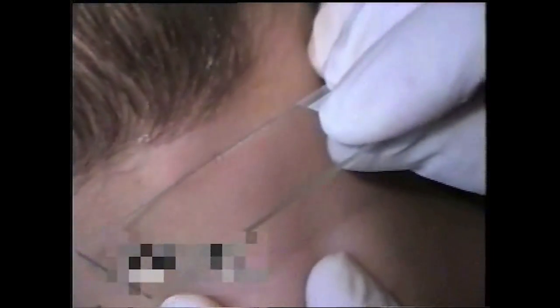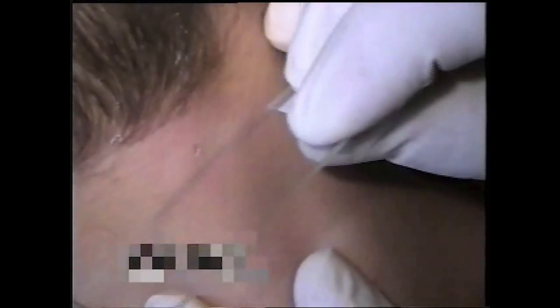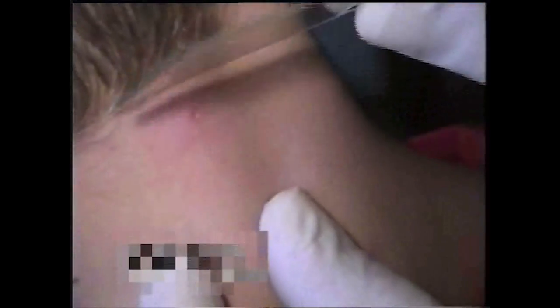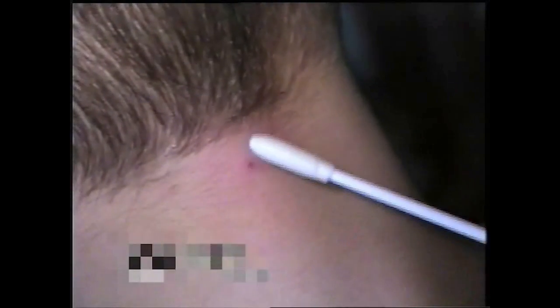Use the edge of a clean slide to loosen and collect skin cells or fluid from the lesion as shown here. Then, using a sterile swab, rub the lesion vigorously enough to ensure that skin cells or fluid are collected.